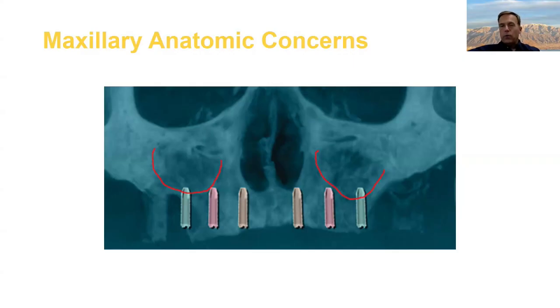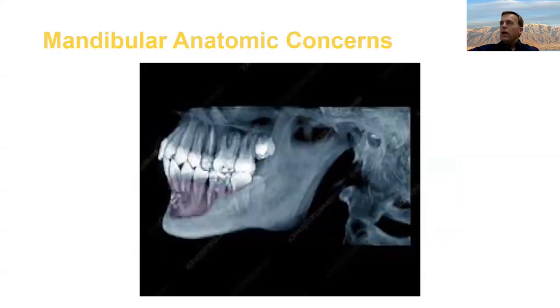So he'll put a cover screw on and cover it. And he said a lot of times when he's looking at these radiographically and testing them, they can be some of his best implants once they've integrated because they have such nice blood flow. So all hope isn't lost with posterior maxillary spinners, other than that we need to bury them. It becomes more of a challenge when we're doing an immediate load type case, because obviously we're not going to want to immediate load an implant like that.